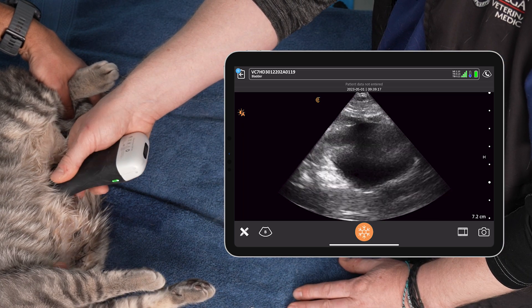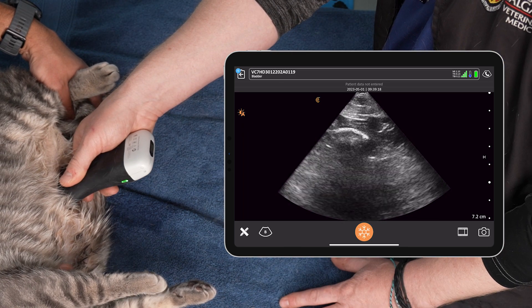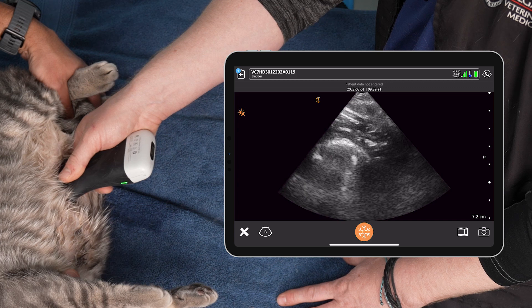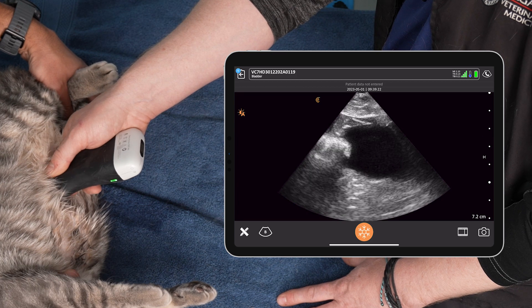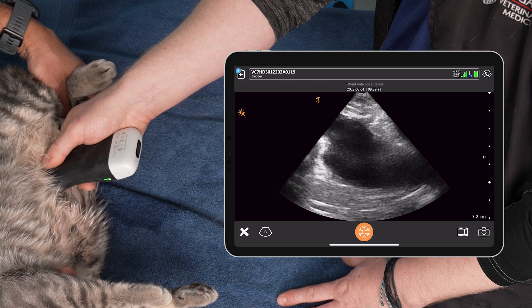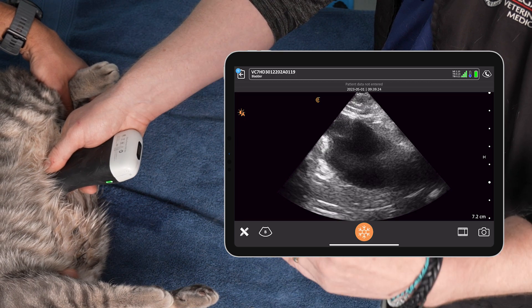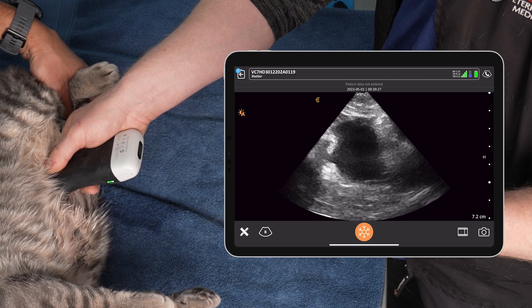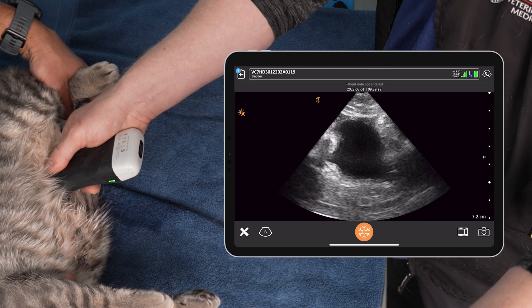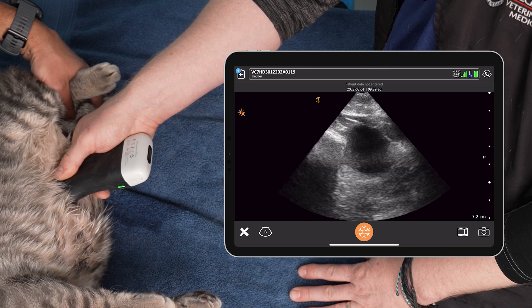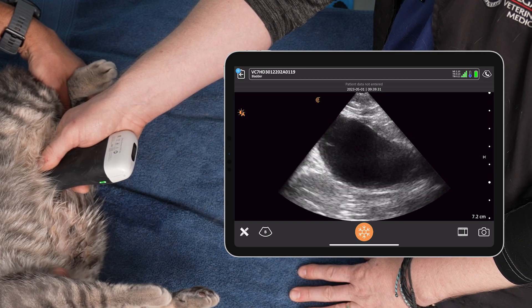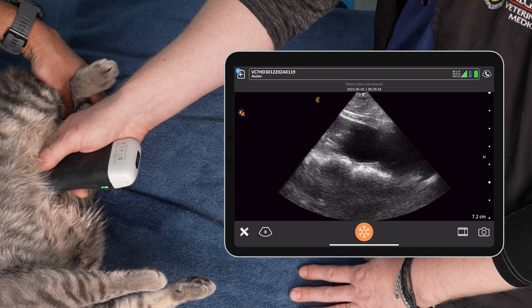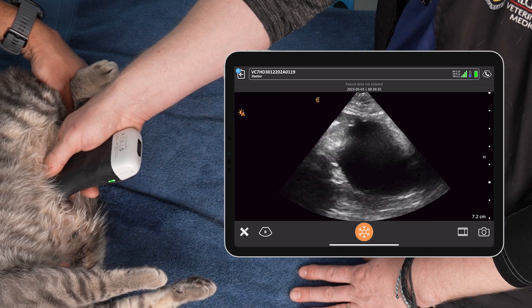The last question applies to intact females — not the case here with Daisy, but in intact females we can look for pyometra by looking beyond the far wall of the urinary bladder, ventral to the colon. Between the bladder wall and the colon in the dorsal regions, we look for fluid-filled structures, which would indicate we potentially have pyometra.